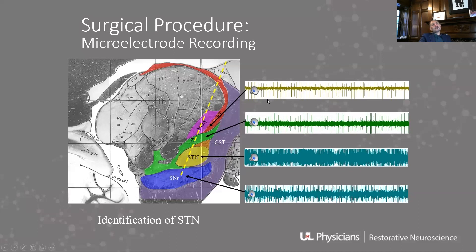You can sort of see from just looking at these traces: the thalamus tends to have these sparse bursting areas of activity. It has a distinctive sound — you go through there and you can hear it.